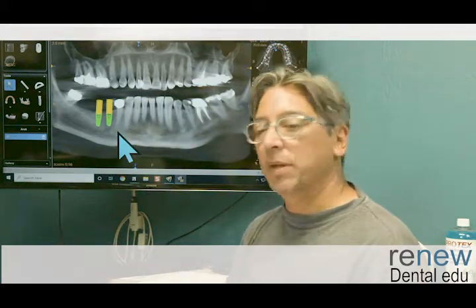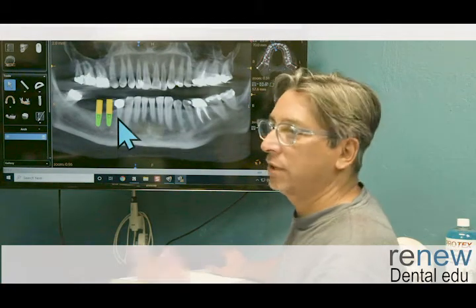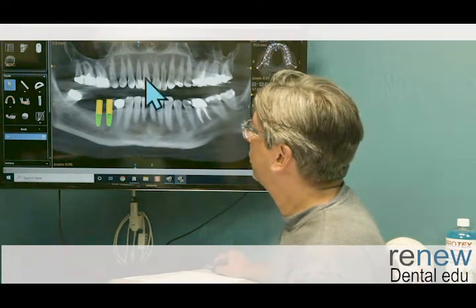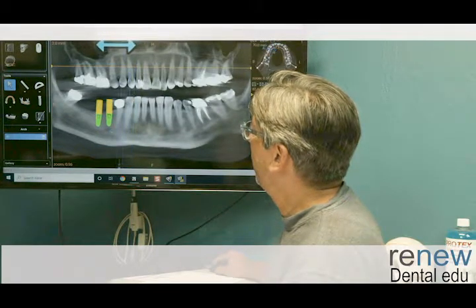Let's look at the treatment assessment here. This is a light green, like I said, bone density. We have a green on the constriction. We have light green on the facial bone. We have light green on the IA nerve. Not much else to say about it. Pretty straightforward, but let's take a look at the CT. I have some implants in here. I'm going to take those out in just a second. But let's look at them with them in there.